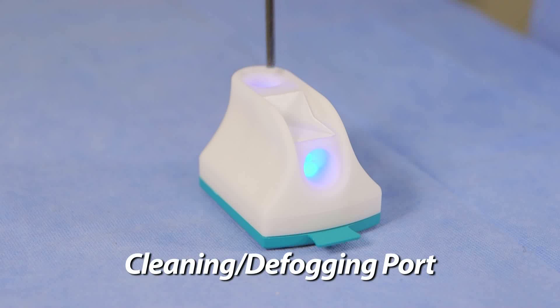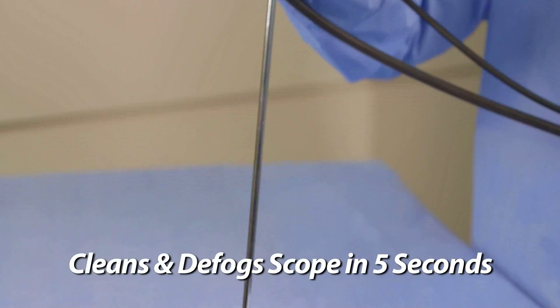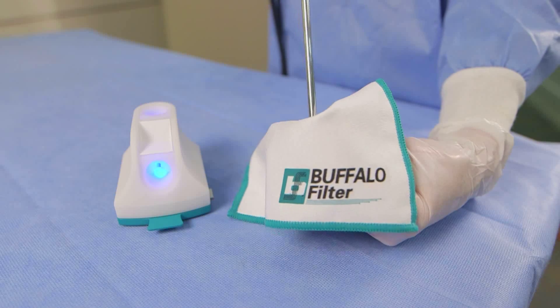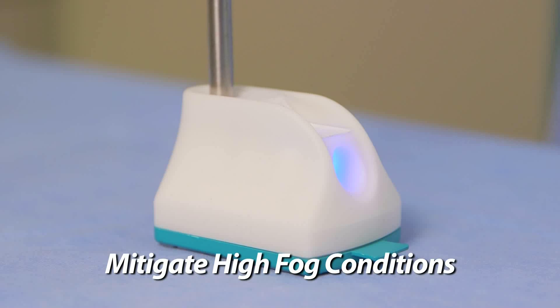To clean, insert the scope firmly into the cleaning and defogging port on top of the unit any time during the procedure. To aid in removal of debris from the lens, agitate the scope inside the port for approximately five seconds. If necessary, use the microfiber surface or microfiber cloth to wipe off any excess debris. Under high fog conditions, do not wipe away all of the cleaning and defogging solution from the lens — gently tap and remove excess fluid.